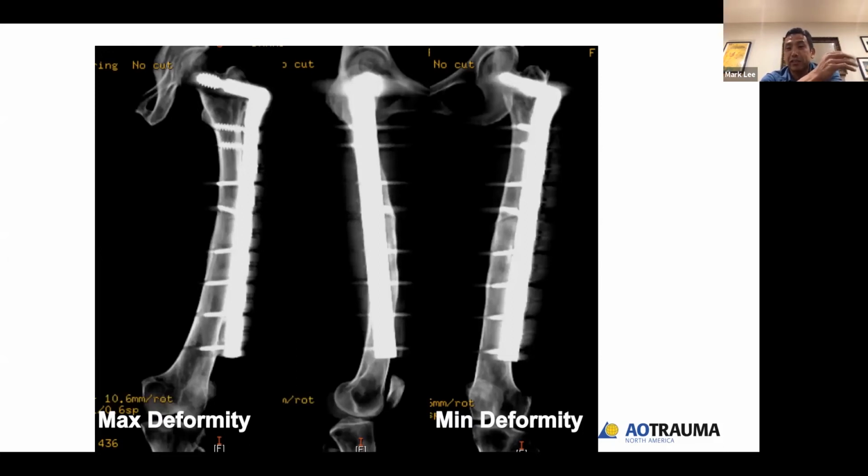I like the continuous CT through the femur, and it is also not to look at the lesions necessarily, that's very specific, but to understand a little bit more about the intramedullary anatomy, because it's helpful for me to know isthmic diameters, narrowings, any abnormalities. You'd be quite surprised sometimes, especially in a post-fracture situation, that a canal that seems continuous is not continuous, or it's particularly wide, and we can get very good measurements of width that can affect the technique.